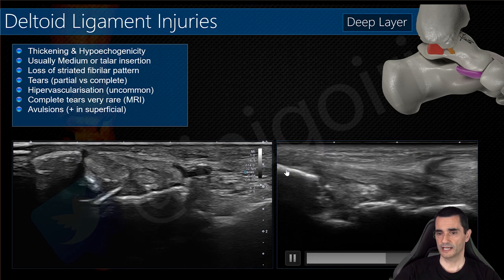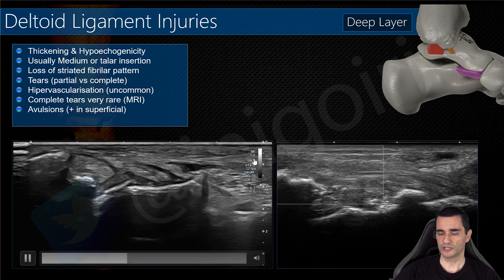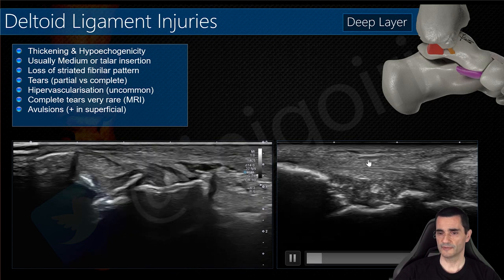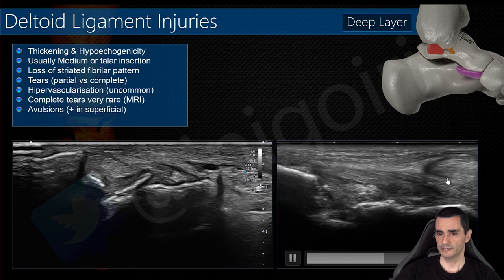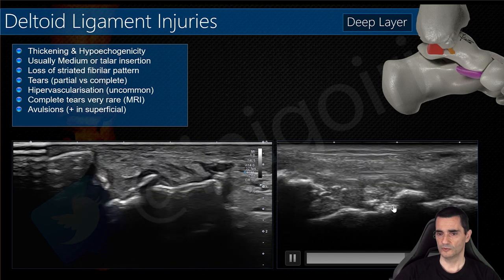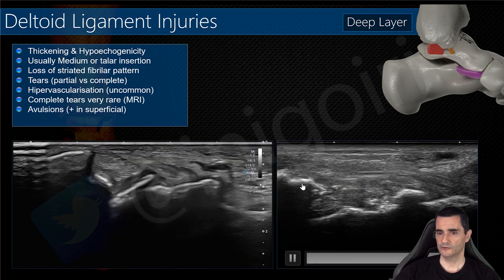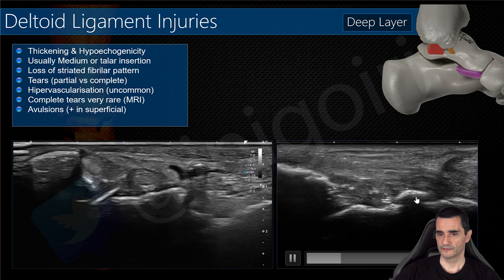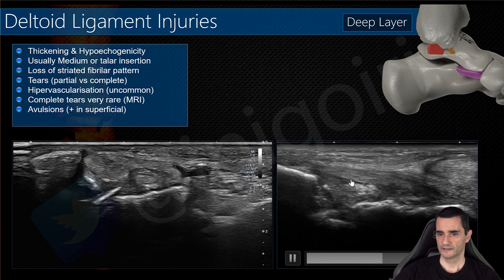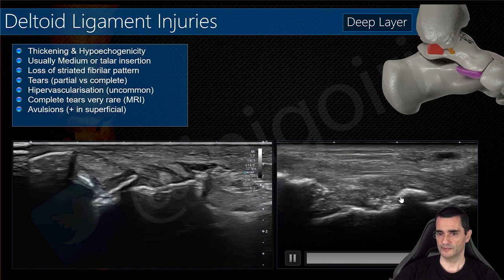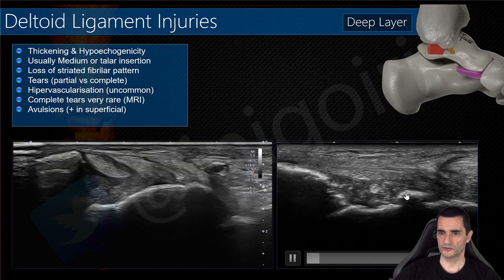Below the tibiospring ligament we will find the anterior tibiotalar ligament. You can notice this injury of the ligament and the avulsion of the insertion of the ligament here.